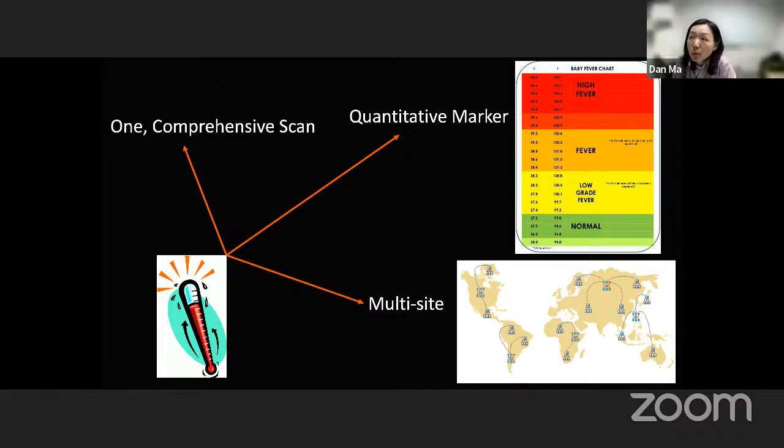Yeah. So the 3% and 8% is deviation. It's more of a variance. Remember, the paper estimated the deviation across the main tissues, for example, white matter and gray matter, across different sites, scans, and subjects.